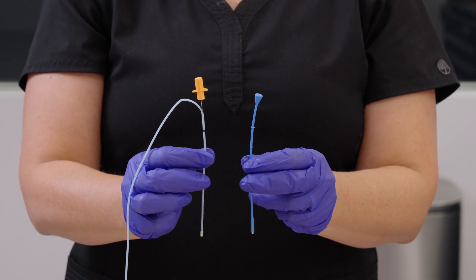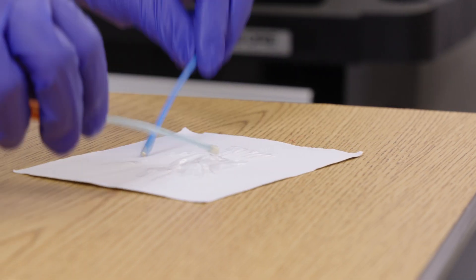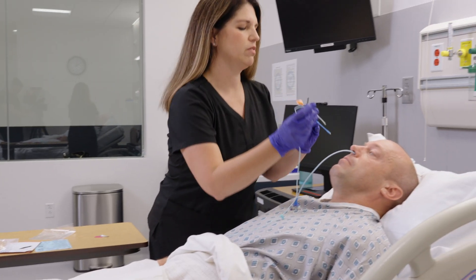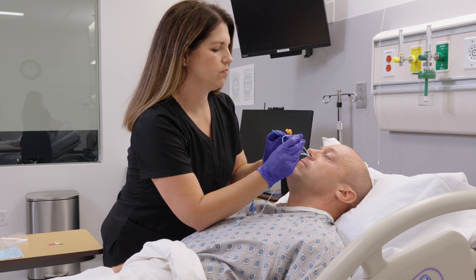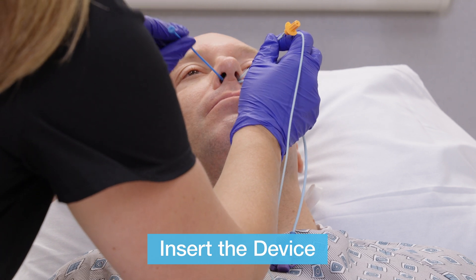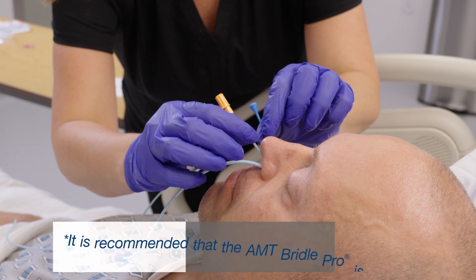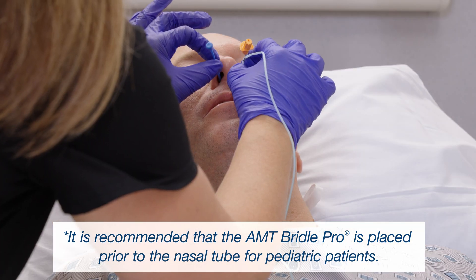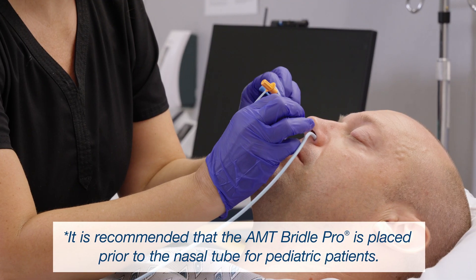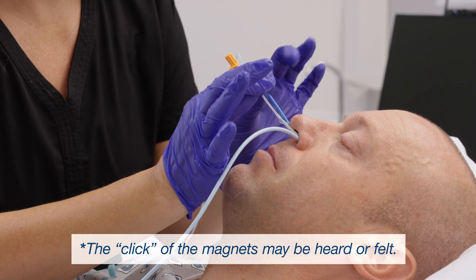The probe will now be inserted into the nostril opposite the nasal tube until the first rib is at the bottom of the nostril. You may make adjustments for smaller patients. Following this, insert the AMT Bridal Pro tubing into the opposite nostril to connect the magnets. Pull back on the orange stylet about one centimeter until the magnets come together. Lining up the depth indicator marks on the probe may assist in magnet connection.